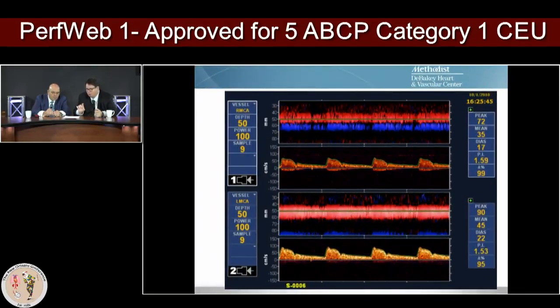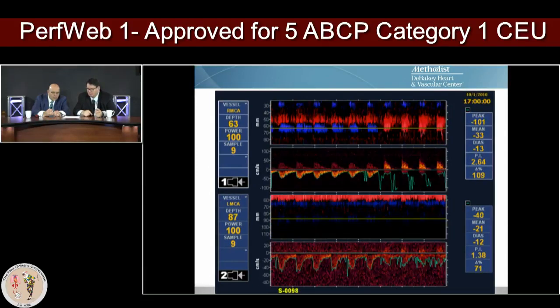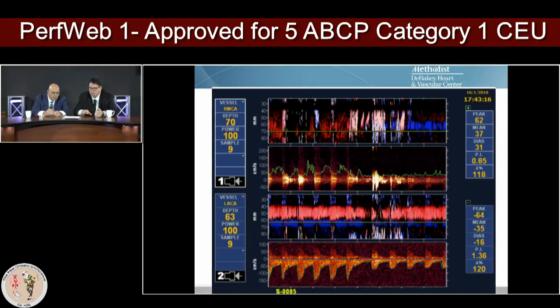This is how we monitor bilateral MCAs. But when we're interested in, say, changes in the ACA, we can also monitor the blue signal, the anterior cerebral artery, because the change of flow direction in the ACA also triggers that there's a problem with your carotid. And I think for open aortic surgeries, that's really crucial. And not just the new technology, how we advance with deployment of the stent and how we're improving the flow, that's a clear confirmation.